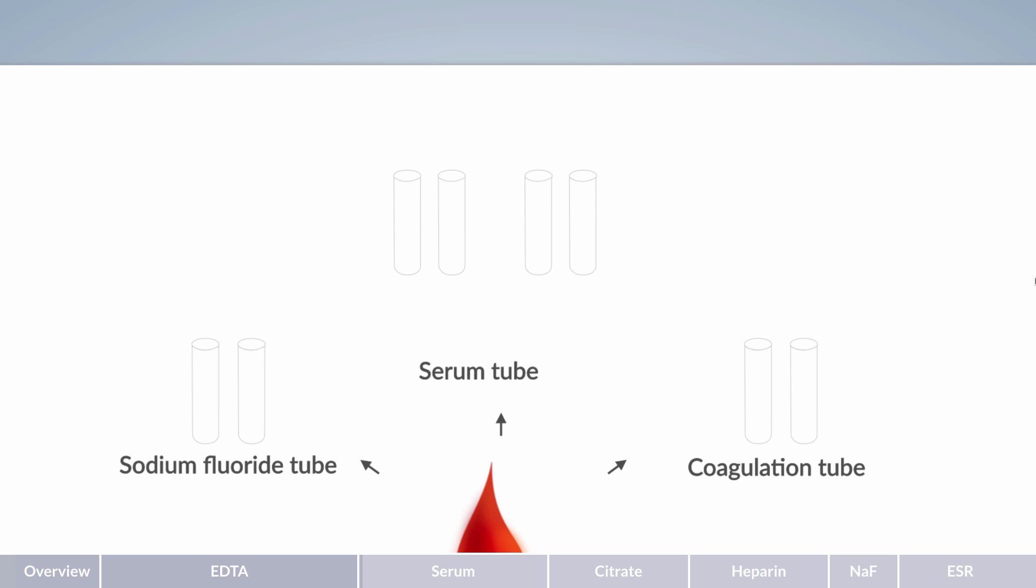A serum collection tube is used if serum is desired for analysis, which is obtained after the blood is allowed to clot. Clinical chemistry analysis of electrolytes, such as calcium, and various liver function tests are usually performed in serum.